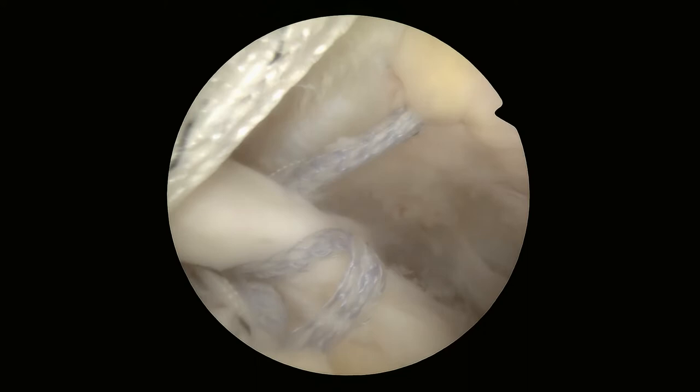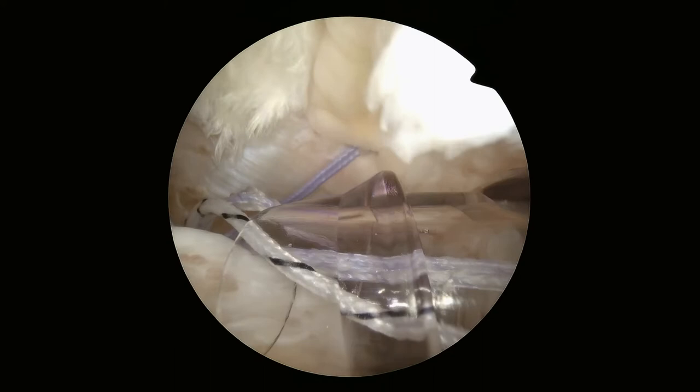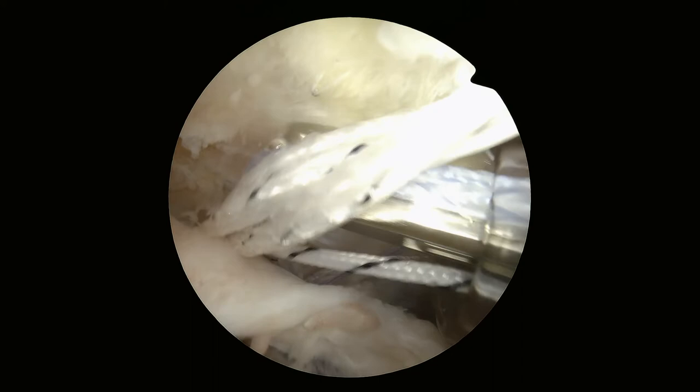Now we're shuttling all the remaining sutures through the rotator cuff. Once that passes, and we do that on both anchors, we grab a limb from each of the anchors that have already passed through the cuff.